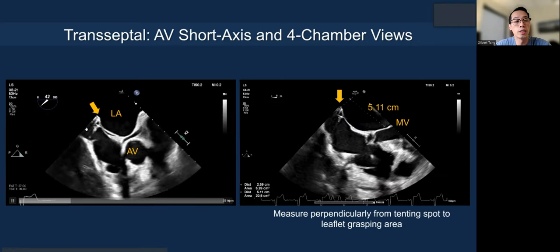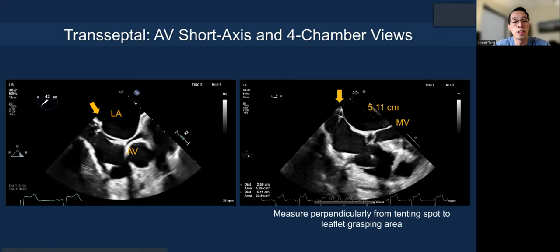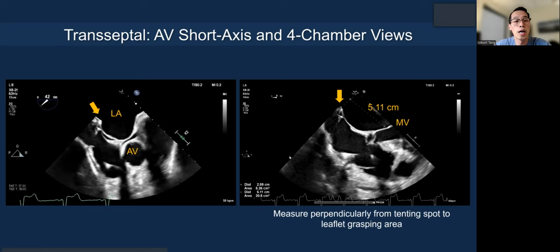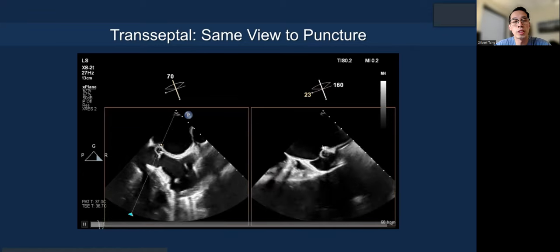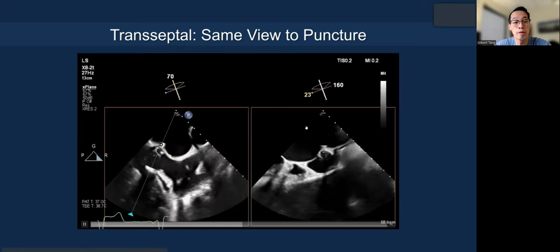Once tenting is done, do an aortic valve short axis view and measure on a four-chamber view to get the transeptal height. With the MitraClip G4 system, with the longer XT clips, you want at least four centimeters, preferably higher if possible — it's always easier to shed height than to gain it afterwards. You must be perpendicular in your measurement. After puncture, you always want to puncture with two views on echo, matched with fluoroscopy. You know exactly how posterior you are, because sometimes the puncture can slip and you don't want to slip posteriorly.